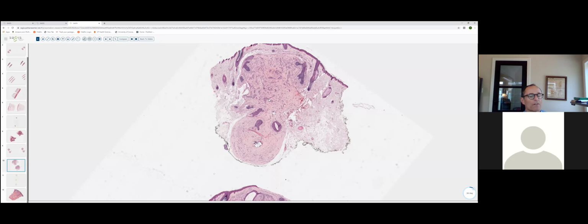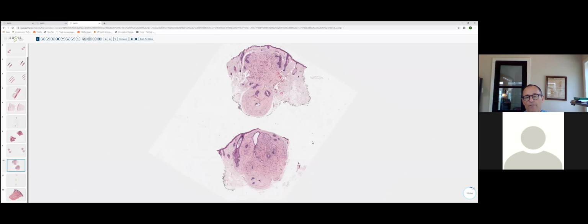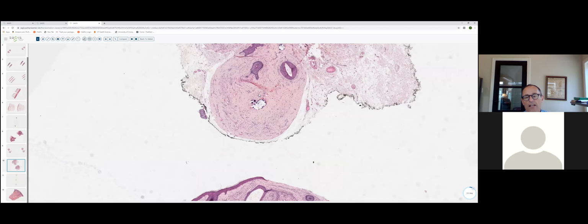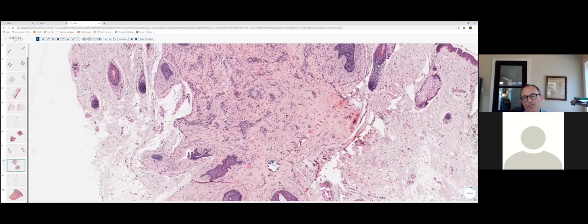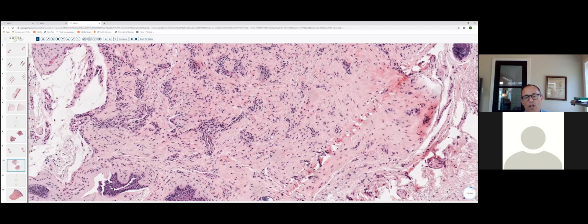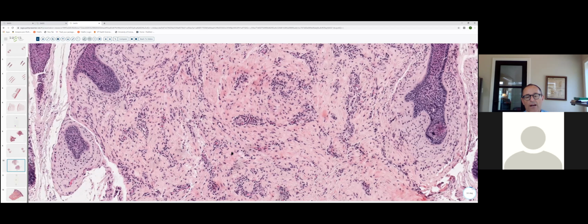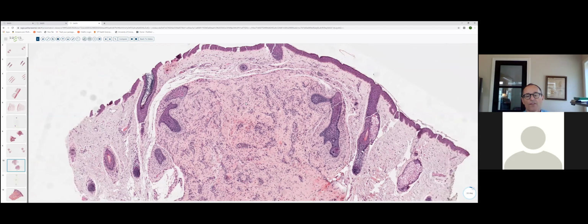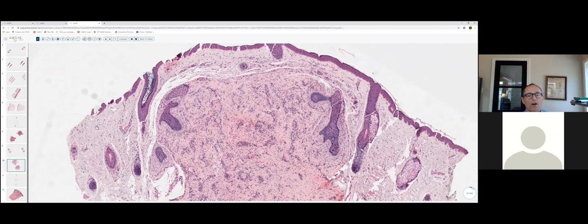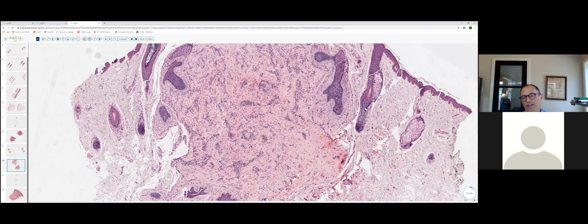I'm going to try and zoom in a little. It's not wanting me to zoom in, so I'm going to go ahead and reload the slide so I can drive it. And let's go and look at the stroma. And sure enough, we can see in the stroma there's kind of plump stellate fibroblasts and a lot of vessels, really more fibrous than fibromucinous, but also embedded within this stroma are these epithelial structures that, again, are kind of primitive.